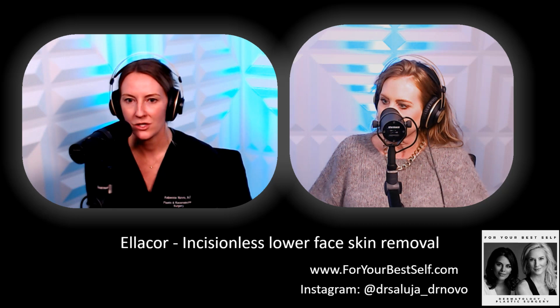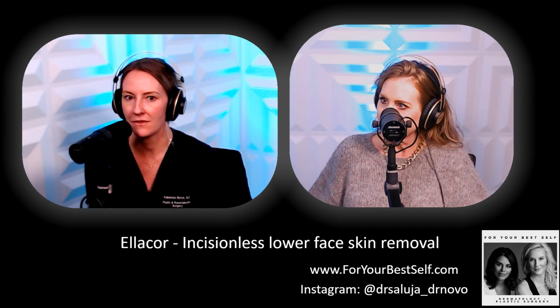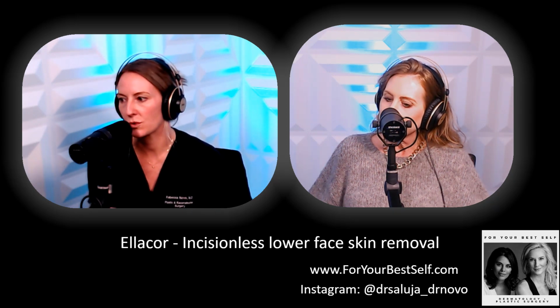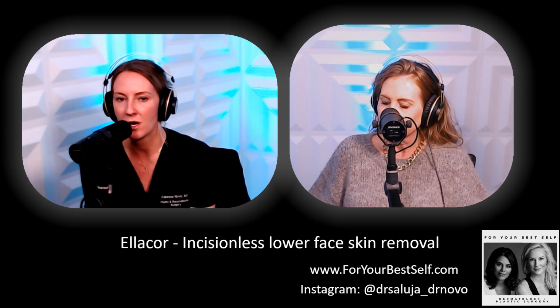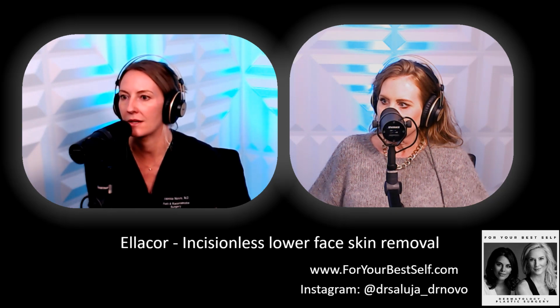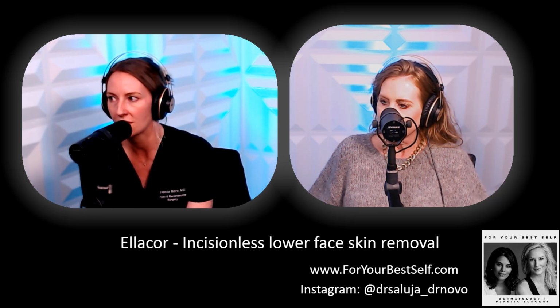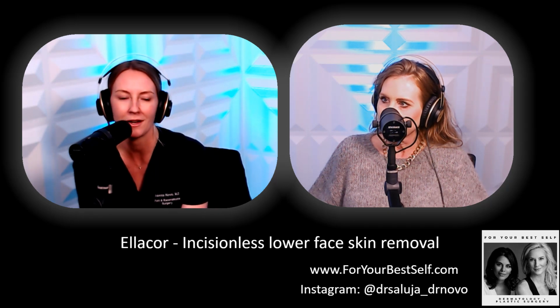So the steps for preparation are, we don't necessarily have to pre-medicate with any antibiotics or antivirals. If you had a strong history of cold sores, we may do some prophylaxis. But really, you come with clean skin, and we will wash your skin as well, and then we'll put on a very special compounded, meaning higher strength, lidocaine, tetracaine. You might be familiar with it if you've had fillers or injectables before. And then we'll offer nerve blocks, which just means injecting anesthesia inside the mouth to target some of the sensory nerves of the face. And then we also add injectable anesthesia once you've had time to topically numb to take the edge off. We basically infiltrate anesthesia under the skin throughout the treatment area.